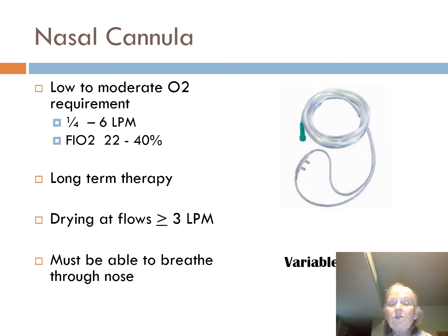In order to use this appropriately, you got to breathe through your nose. So if your nose is all stuffed up, we got a problem. You'll see this on occasions. We'll have our patients who are somewhat out of it a little bit, and they're breathing through their mouth, and we'll just take the cannula. You can clean it off with alcohol and then just put it in their mouth, and it works.